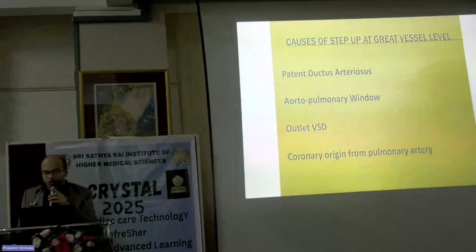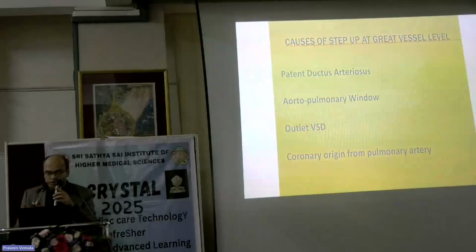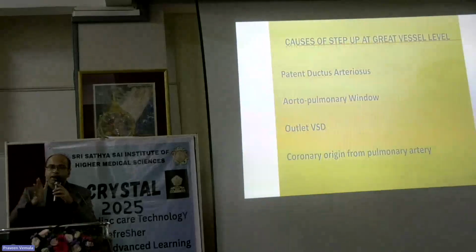Now, if you see that, you should alert your surgeon, you should alert your team. Is there a residual PDA? Is there a residual VSD? Then we take it up for a cath. It comes back to us in cardiology. So the surgeon will say, is it significant? Tell me. So then we go back and check and say, yes, your PDA is still residual. I might have to put a device, or you might have to go down and then revise your VSD.